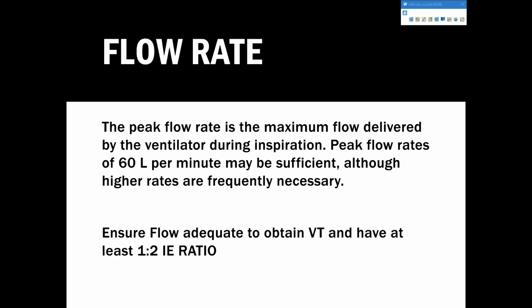If you're on very high respiratory rates, 28, something like that, 1 to 1.8 might be the best you can get. But you never want to have a 1 to 1. You never want to have anything less than 1 to 1.2 unless you cannot help it. Okay, and make sure you're giving them enough flow. We should not have flow set to 30 or 40. 45, 46 sometimes is okay for little old ladies or something, but for the most part, I would start with at least 50 on your peak flows on almost everybody, and you'll be a lot better off.